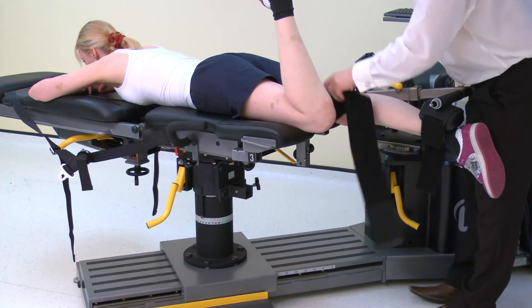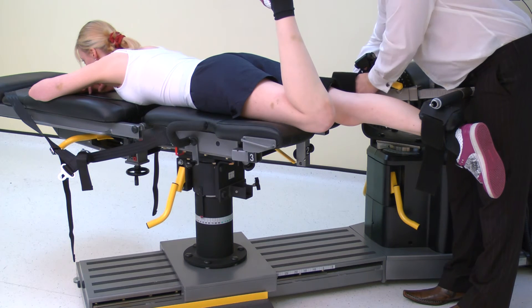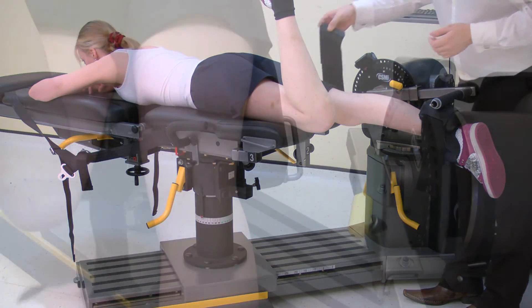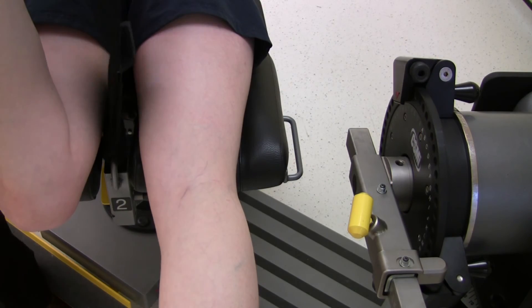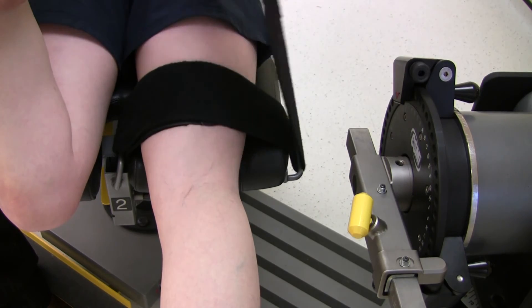Now attach the thigh strap to the leg to be tested. Top tip: subjects prefer the strap tight; however, an overly tight strap can affect the results. Pull the strap to tension, but do not lever into place.